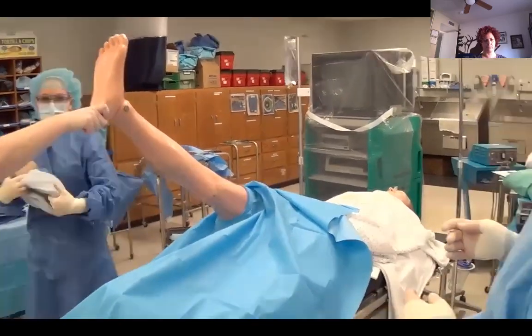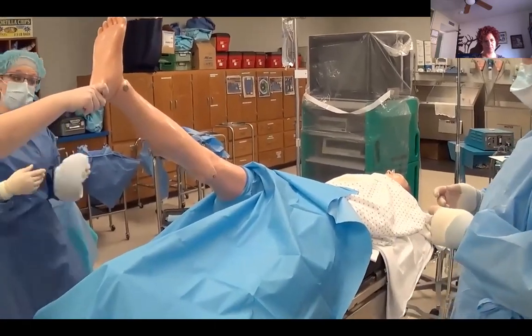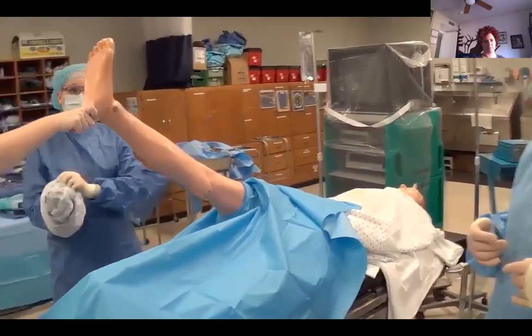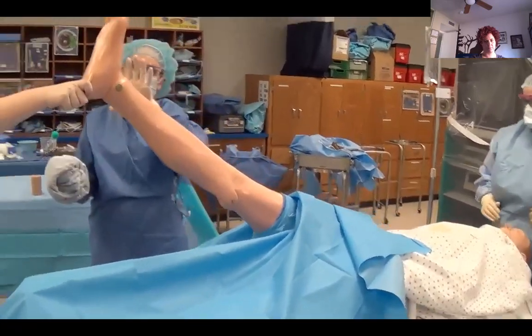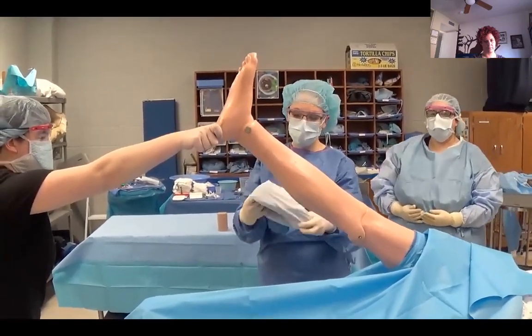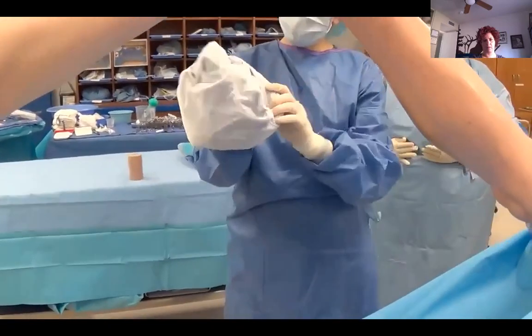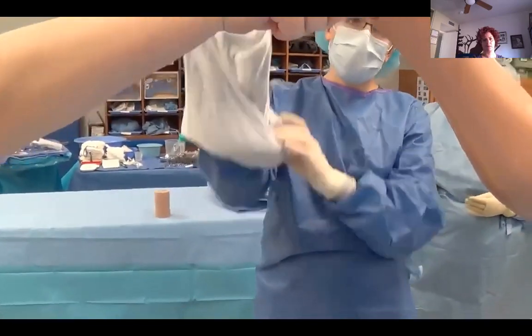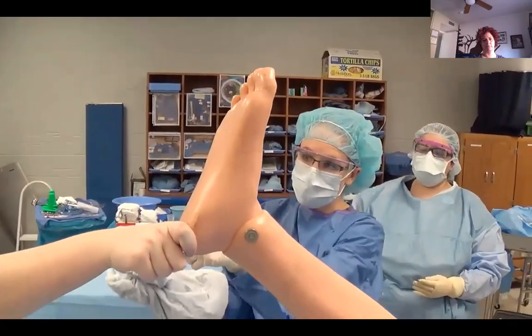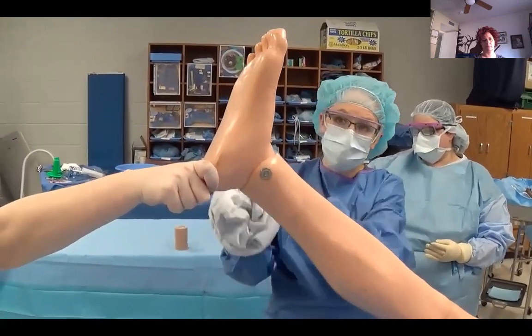All right, now, it's likely that the foot has not been included if we are doing a knee case, such as a knee arthroscopy. So if I have an area that has not been prepped, I need to place what's called an impervious stockinette over the top of it. So this is what a stockinette looks like. It comes rolled in the pack. You're going to want to kind of roll it back over your hand as you come to grab the foot so that your hand doesn't get contaminated by this unsterile person who is holding onto the foot and also this area that hasn't been prepped.